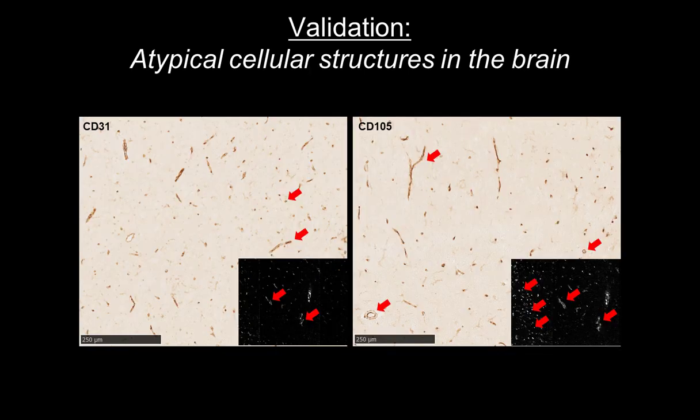And so, I think one of the things that was challenging early on with this is validation of these markers. With a lot of the tumor immune stuff that I talked about earlier here, we were able to use a lot of control immune tissues like tonsil and lymph node to use the known geography, known shapes of cells to validate things.